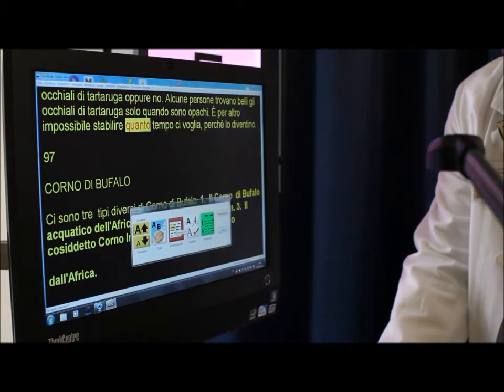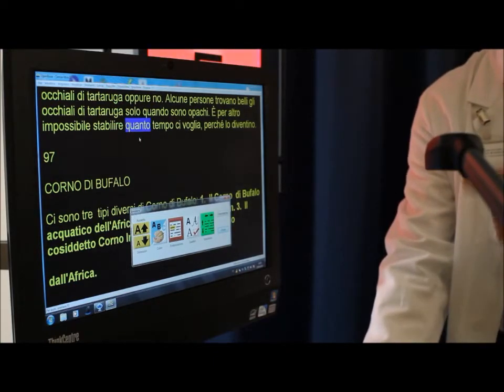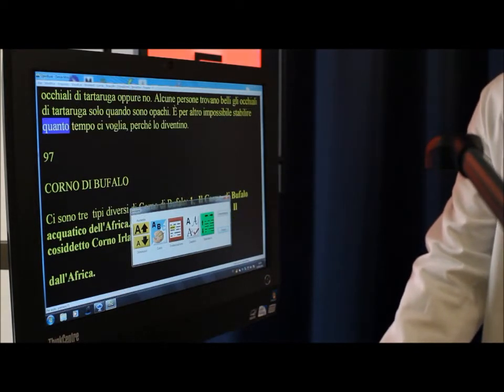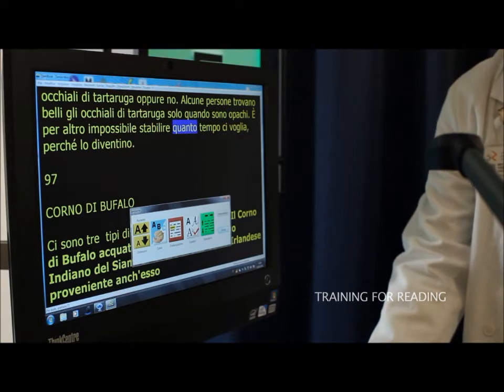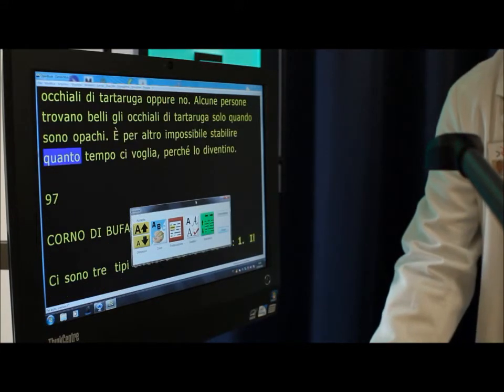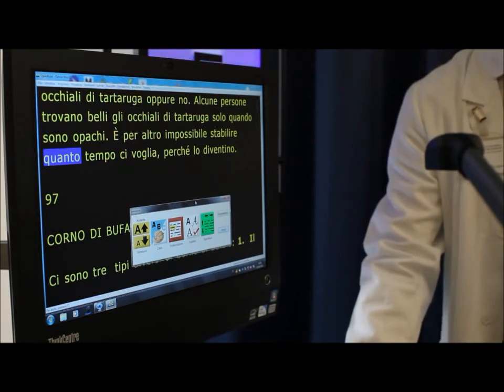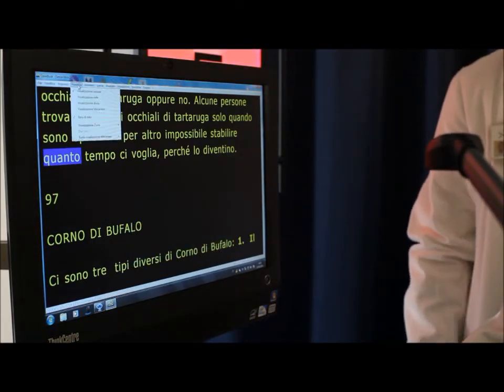We set the reading speed based on tests performed with eyeglasses and light, and ask the patient to follow the cursor. When the patient gets ahead of the cursor, the speed of the automatic scrolling is increased to the theoretical number that has been established by the program. To complete the training cycle, when the patient has reached the maximum possible result, we bring the text that we have digitized back to its natural state to see if we have reached the goal set at the beginning of the meeting, namely, a return to reading books.